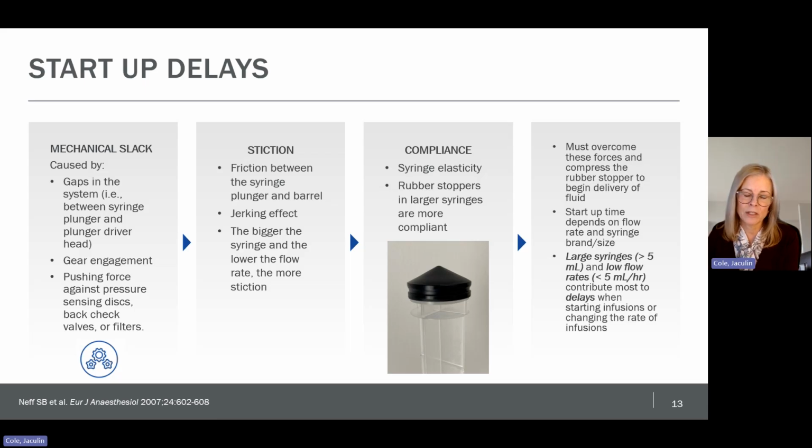Compliance is syringe and administration set expansion and contraction due to pressure. And compliance is related to the elasticity of the syringe and the compressibility of that rubber stopper. Plastic syringes can swell when pressure is exerted in the syringe. You're not actually going to see that, but it can occur to a degree that affects the flow.